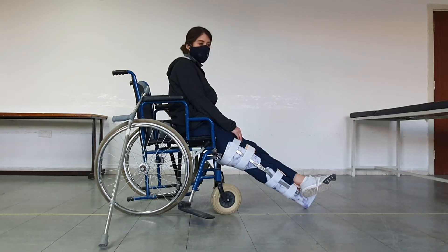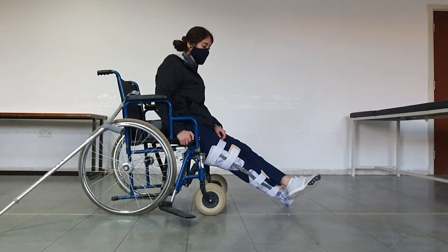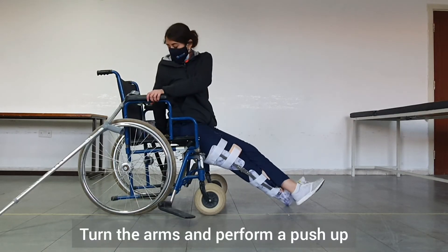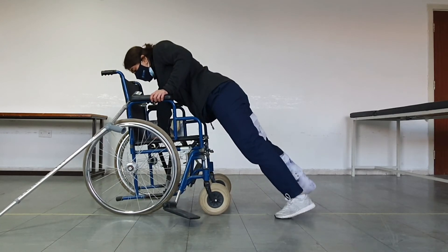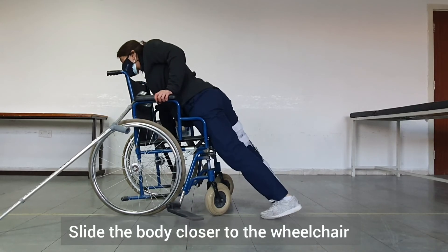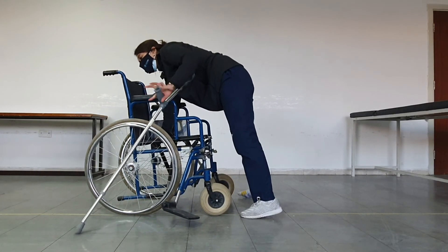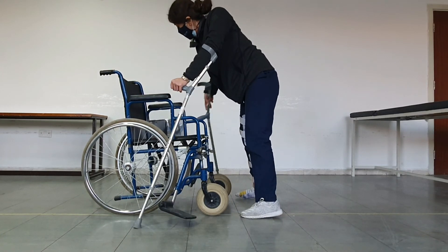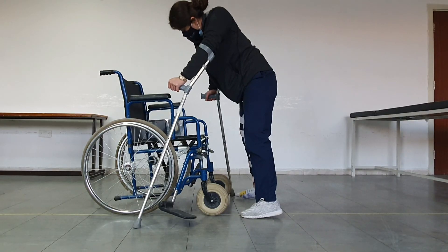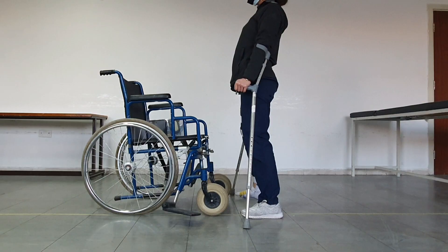Now the hardest part will be to do a push-up with the arms by putting them on the sitting area of the chair, turning the arms to the sitting area, doing a push-up on the sitting bars, and twisting their trunk. They could slide themselves to bring themselves closer to the chair. Then hold one crutch and stand on it, and do the same with the other crutch. Now we are in standing position while using the two crutches.